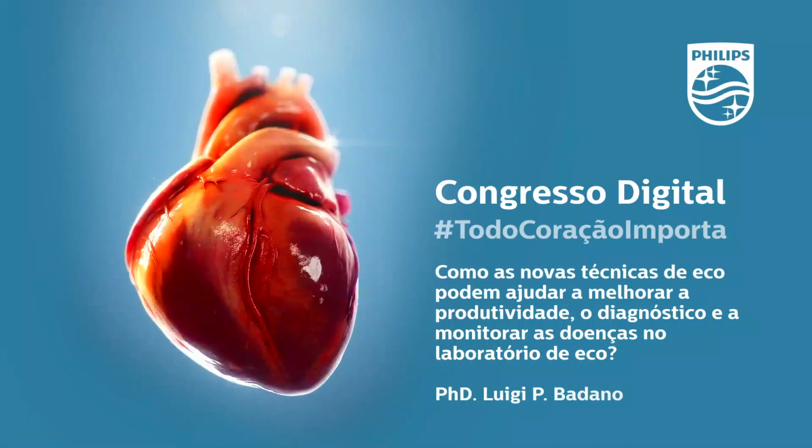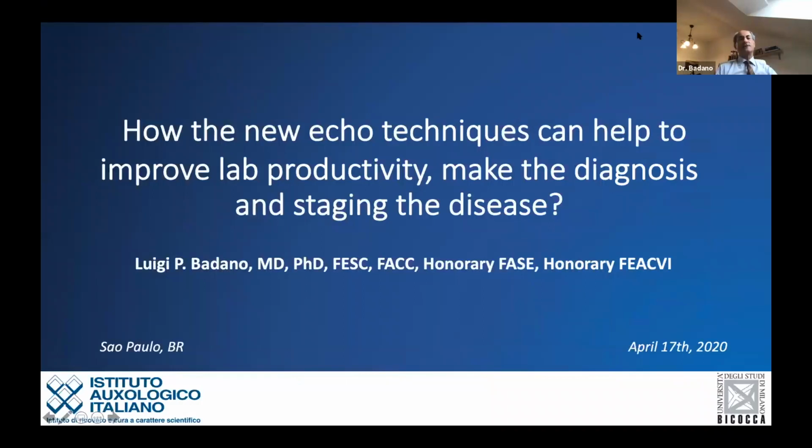So I will start the first presentation with a clinical case that shows how we can take advantage of the new echo techniques that have been developed in the last year, not only to improve our laboratory productivity, but also to make a difficult diagnosis and stage the disease in a way that has been unprecedented with the conventional echo techniques.